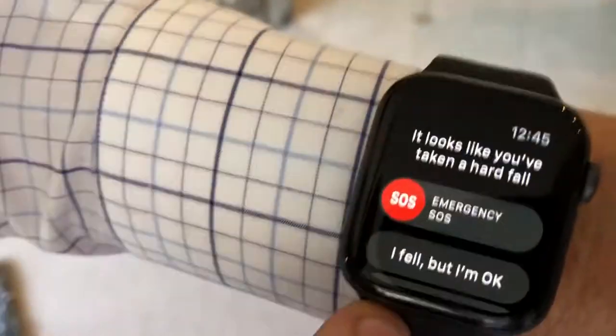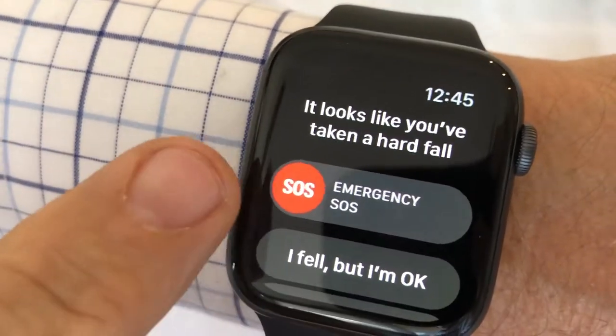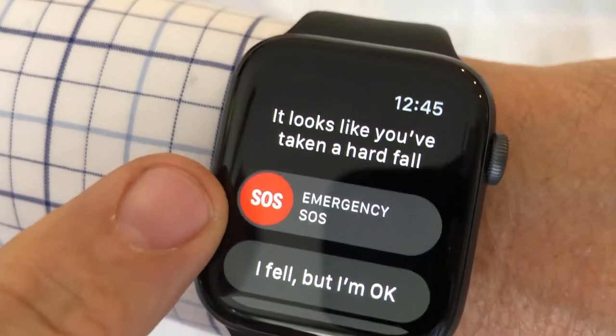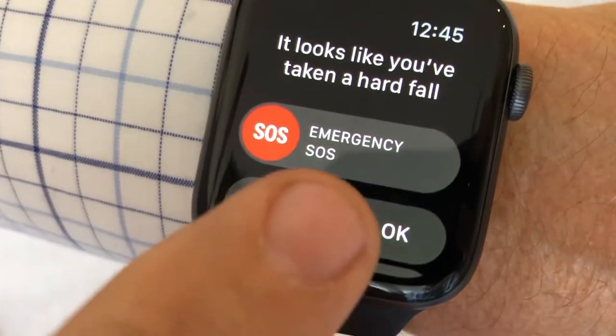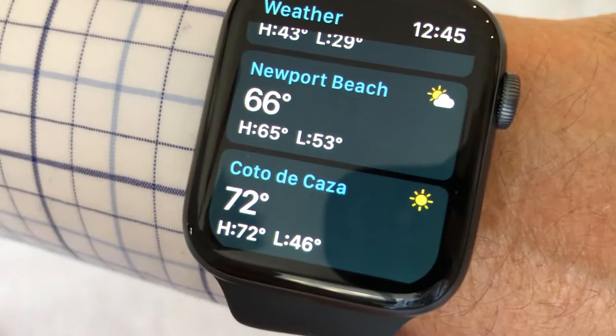Here is an actual fall detection. SOS — if you push SOS, it means you got hurt; that will call the next person in line on your phone. If you push the other button, 'I fell, but I'm okay,' it will reset the fall detection.